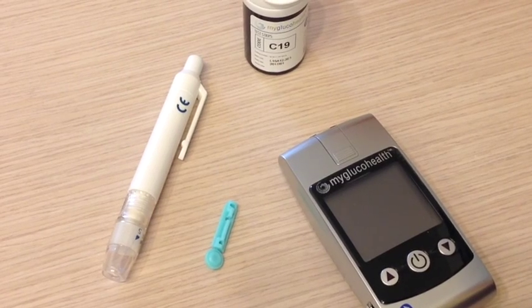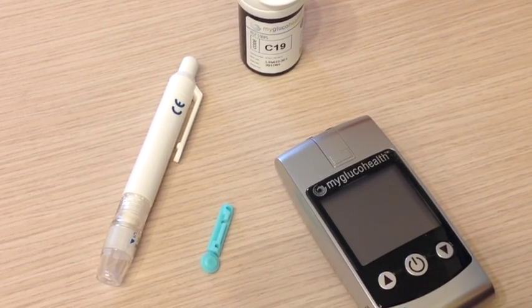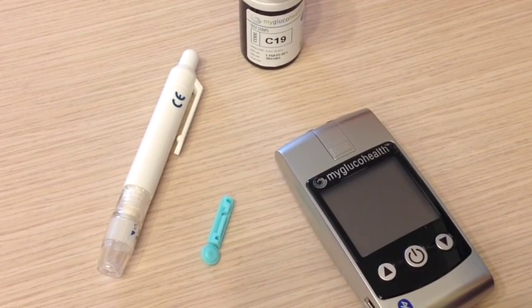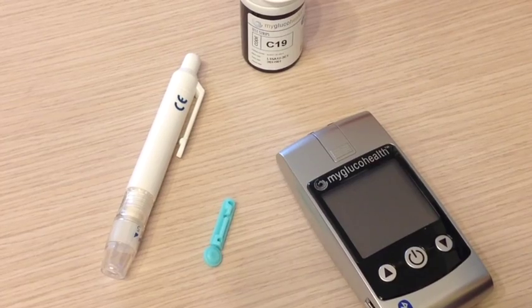We're going to be doing a demonstration of how to use the MyGlucoHealth glucometer. We use this meter for several of our drug studies here, and it works a little differently than a traditional meter.